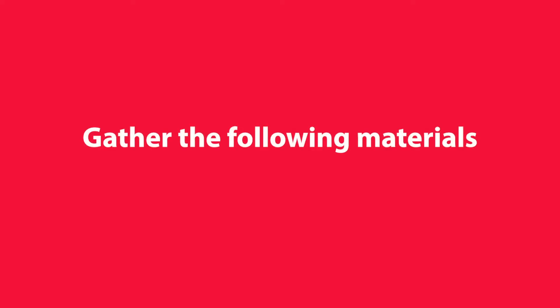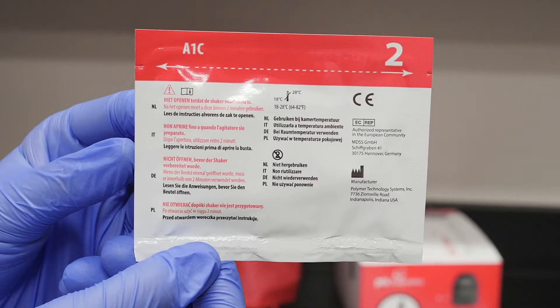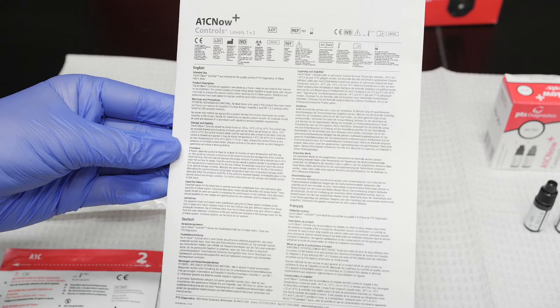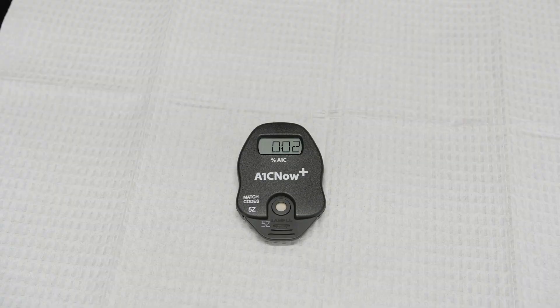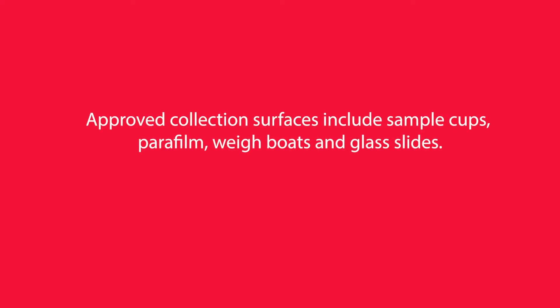Then gather the following materials: the A1C Now Plus test kit components, the A1C Now Plus controls materials, the quality control instructions which can be found in the box, and a clean flat surface. Approved collection surfaces include sample cups, parafilm, weigh boats, and glass slides.